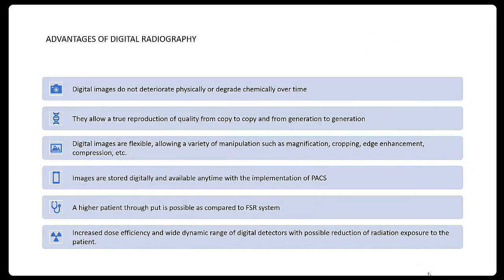So, before coming to digital radiography, comparing to the conventional radiography, we have much higher advantages in the field of digital radiography. So, let's compare what are the advantages of digital radiography. So, first thing is digital images do not deteriorate physically or degrade chemically over time. So, this is a better advantage, right?